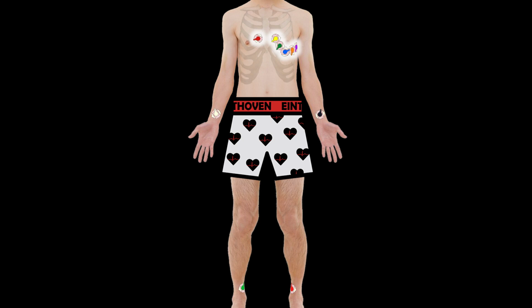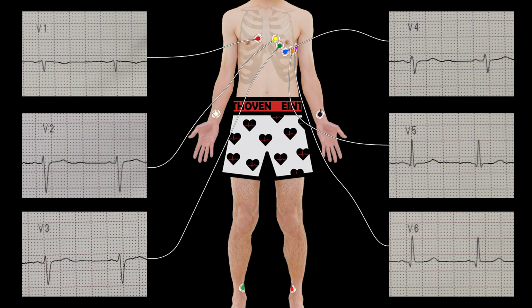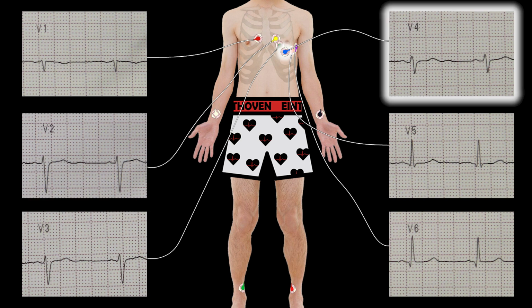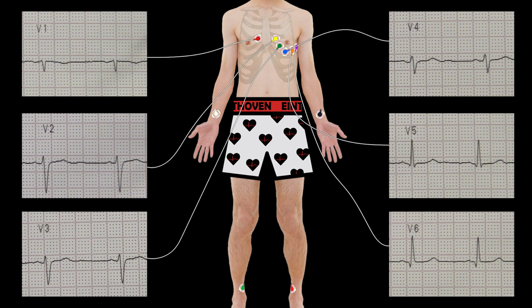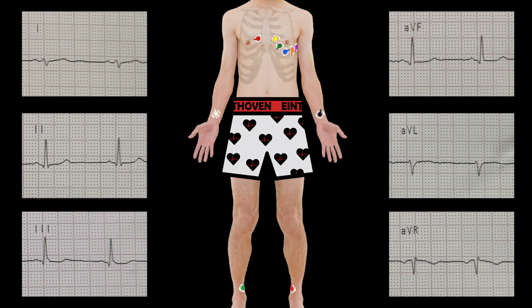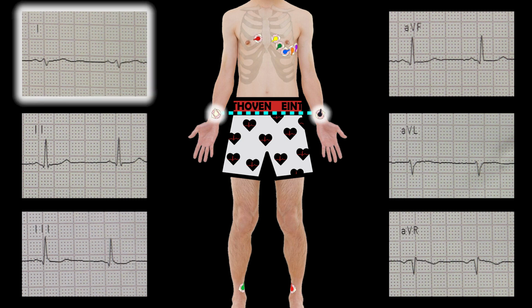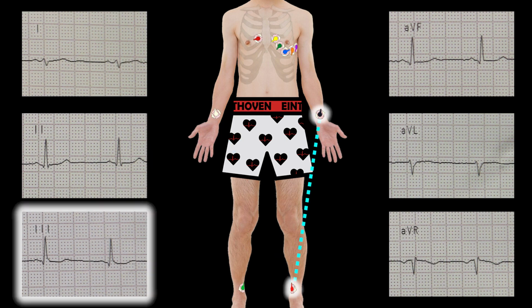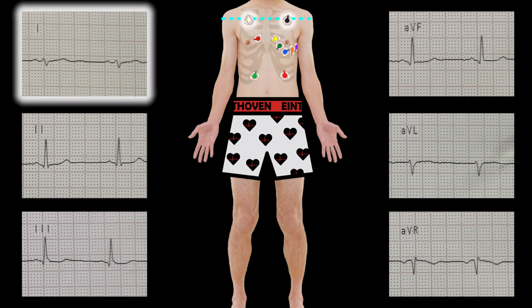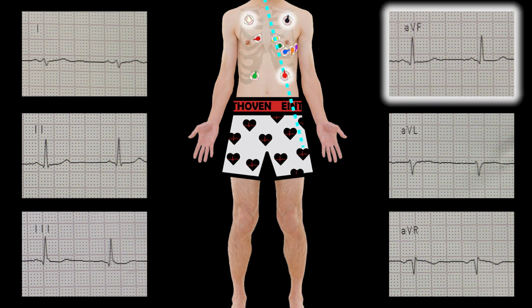We have 6 electrodes on the chest that make 6 different leads. Notice that the EKG changes slightly in each one. This is because each lead is measuring depolarization from a different angle. The electrodes on the limbs create 6 more leads. This includes the most common ones like lead 1, lead 2, and lead 3. The limb electrodes can be placed anywhere along the limbs as long as they match. So wrists and ankles, elbows and knees, shoulders and hips. They can even be placed on the torso. Each lead is at a different angle and records a different EKG tracing.